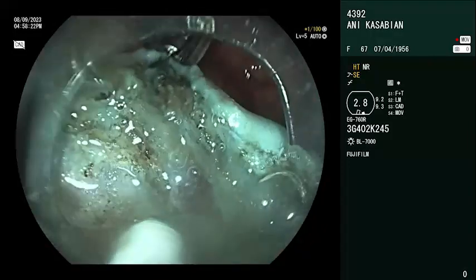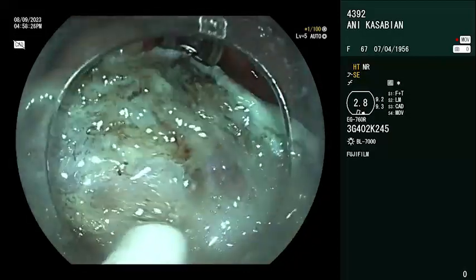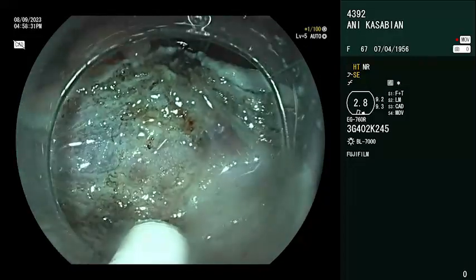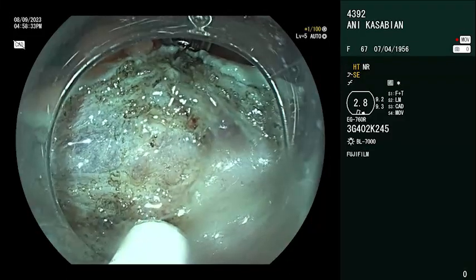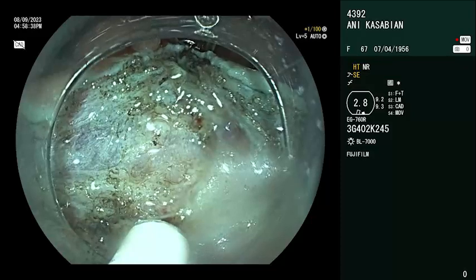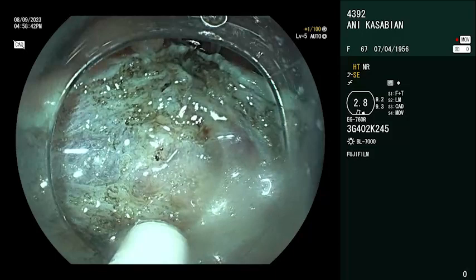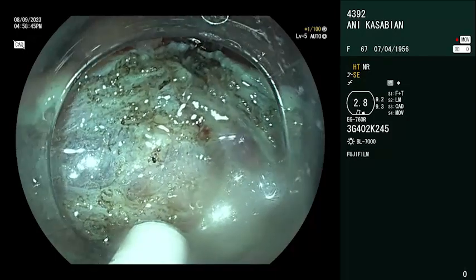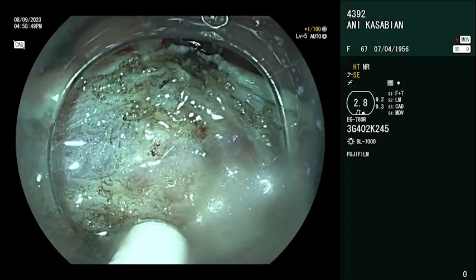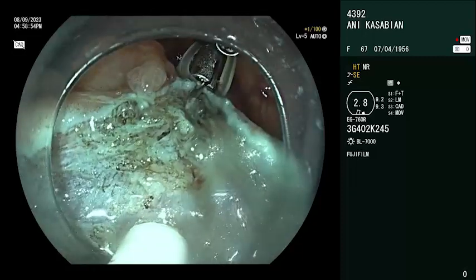Then I use a gastroscope, Fujifilm 700 series. We make the characterization just before, and there was no sign of invasive cancer and deeper invasive cancer. Probably there is only adenoma, but because of the fibrotic area, the dissection, and because of the granular part more than 1 centimeter, we have a risk of a tumor cell inside the lesion.